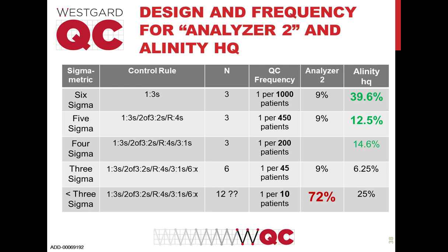There's no perfect instrument. There are some areas, some of the differential counts are particularly challenging, and those will need more Westgard rules and possibly more controls. But if you look at the overall performance and if you have to synchronize how you're going to do QC, you're probably going to do it on a reduced frequency with reduced rules and therefore reduced expenses.